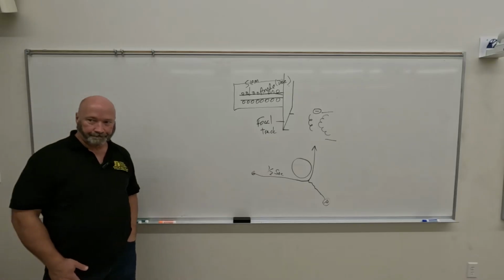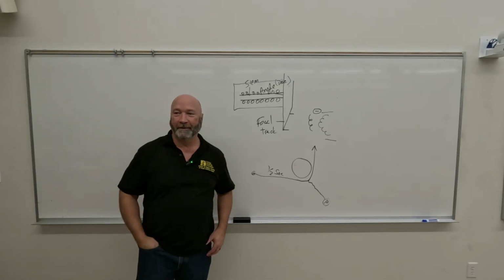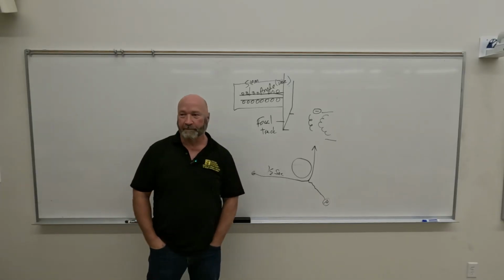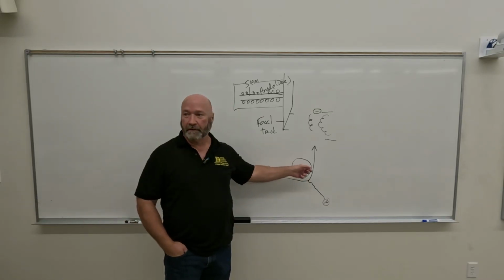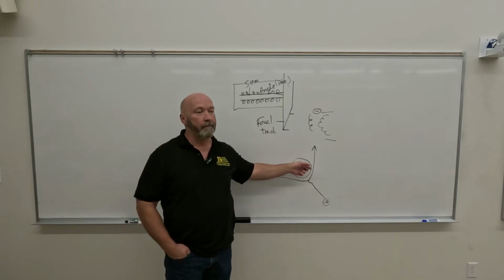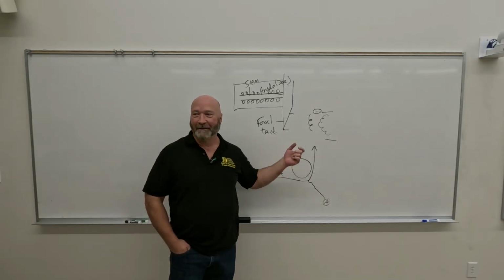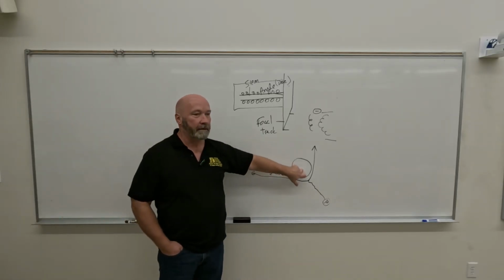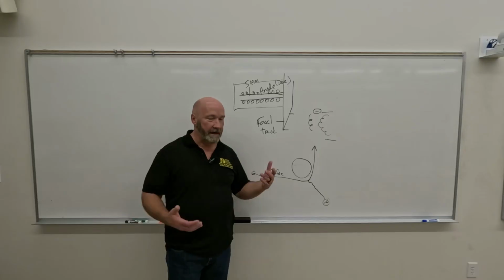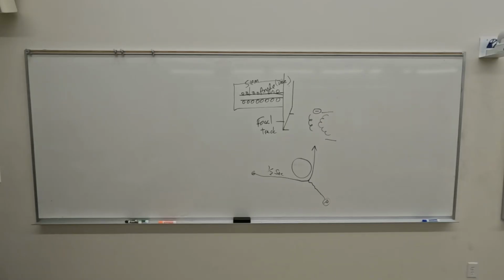Lead. What does it take to melt lead? It doesn't take much. You can pretty much melt it on the stovetop. So from a characteristic standpoint, would it be good? It'd be phenomenal. But how many exposures are you going to get off of a lead target? One, and you're going to be done, right? So we have to have two things. We have to have a good big atomic number, but we have to have something that can handle a big heat load. So back over to page 117, it has a high melting point.